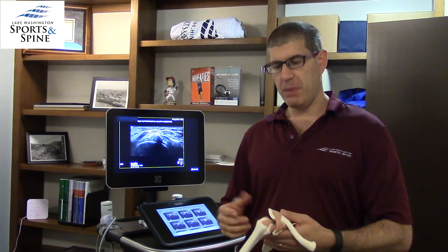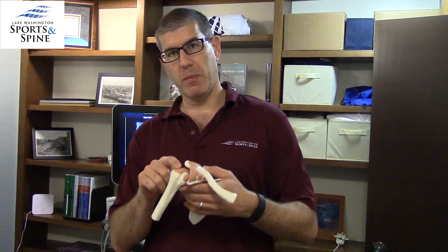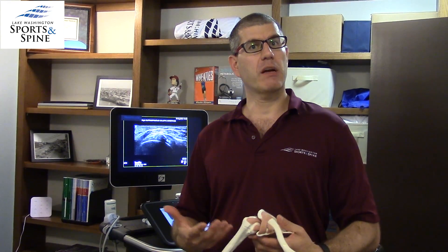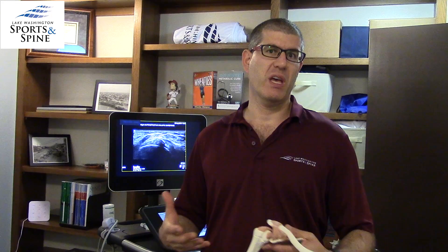One of the things that can happen is little calcium deposits can form in this tendon, and historically this has been a tricky injury to treat. But we want to talk about an innovative use of musculoskeletal ultrasound to help treat this. This is called a calcific tendonitis barbotage procedure.